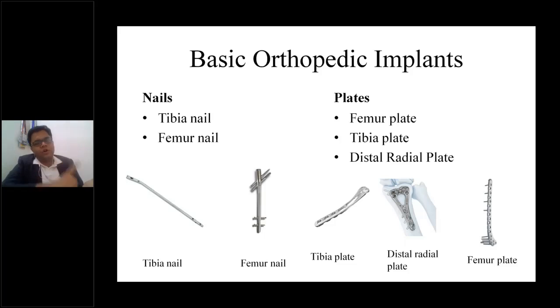They give the doctors and the patients at a cheaper rate, and many of the surgeons are using these implants without validation and without reporting. And you see, when they are not properly customized and validated, there is a breakage of the screw, there is a breakage of the nail, there is a breakage of the plate, and there is no standard hex or screw removing instrument which is available.